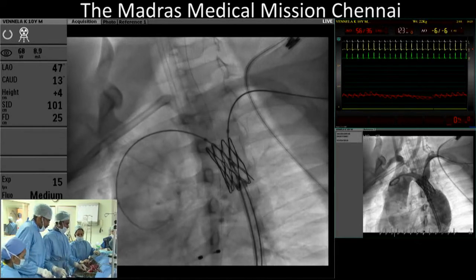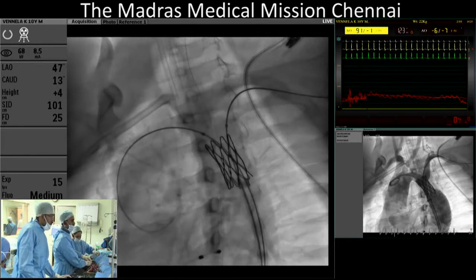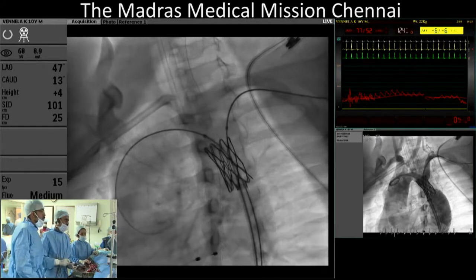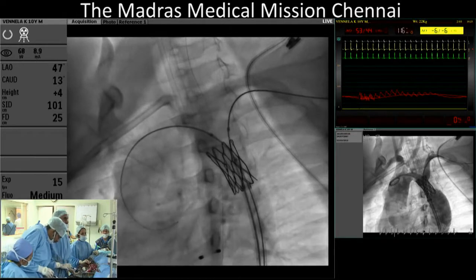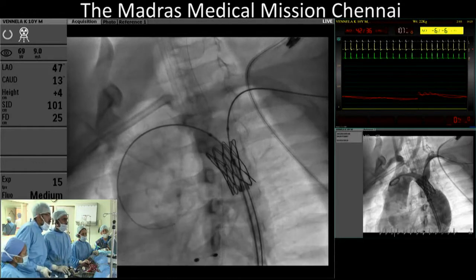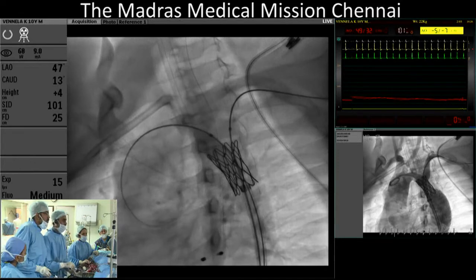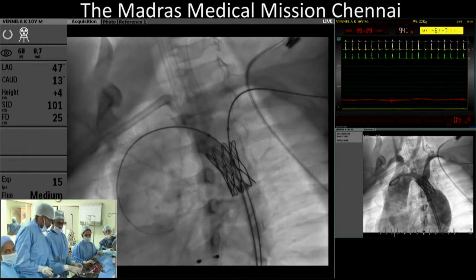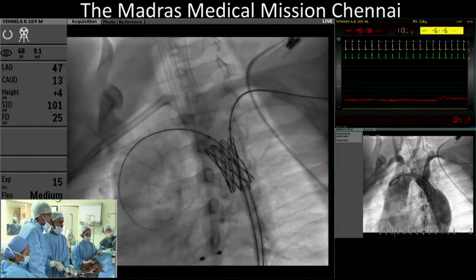So, one more comment to Nick: this patient will need re-intervention anyway. She's going to grow another 6 years. I think the result at present is good. 50% of all coarctation patients will remain hypertensive, irrespective of everything. And I think one can always tackle the transverse arch if it should become a problem in future at a later stage. Yeah, I fully agree. Now, having a stent pretty large there, you're seeing now flaring the distal portion of the stent. You're going to have a very nice access to the transverse arch if needed in the future. Yeah.